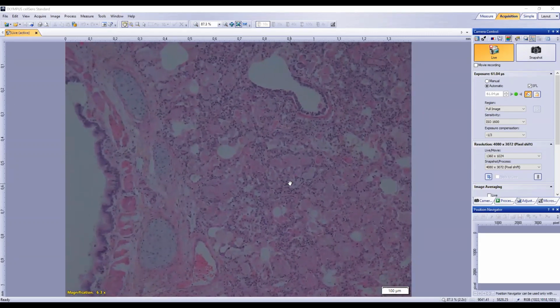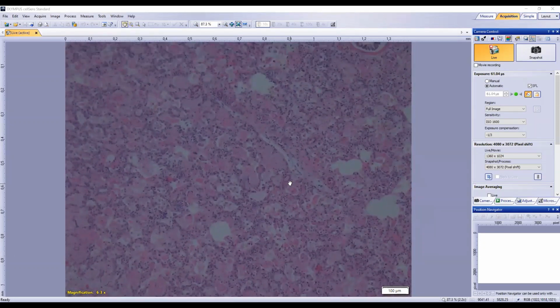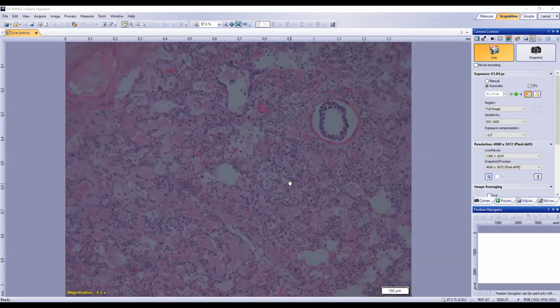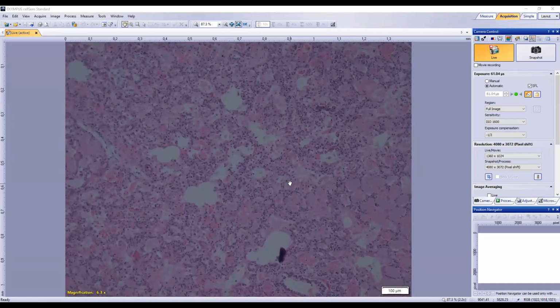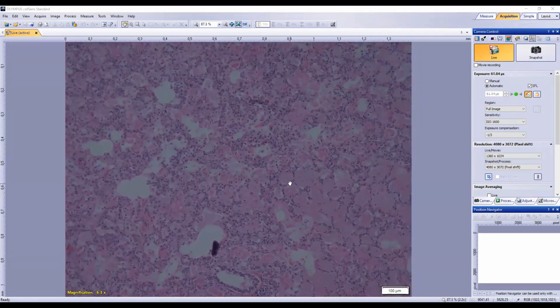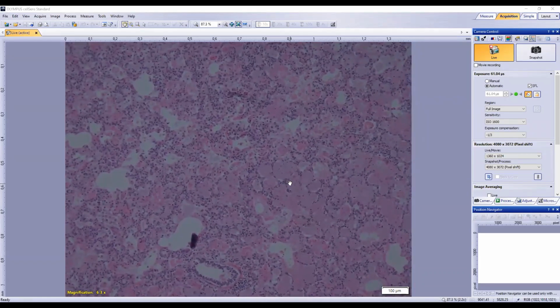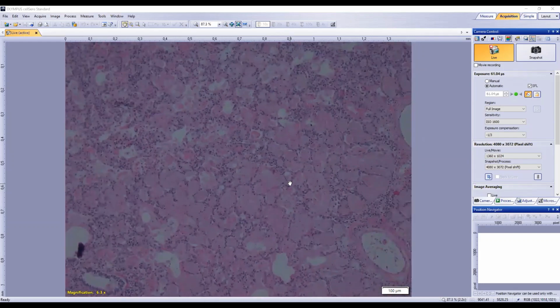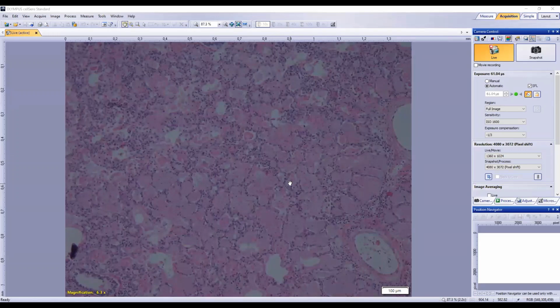Could be herpes 4. Herpes virus, yeah. And psittacosis. Maybe. Interesting. That is an interesting one, because I don't know that I've seen a Chlamydia psittaci pneumonia in a horse before.